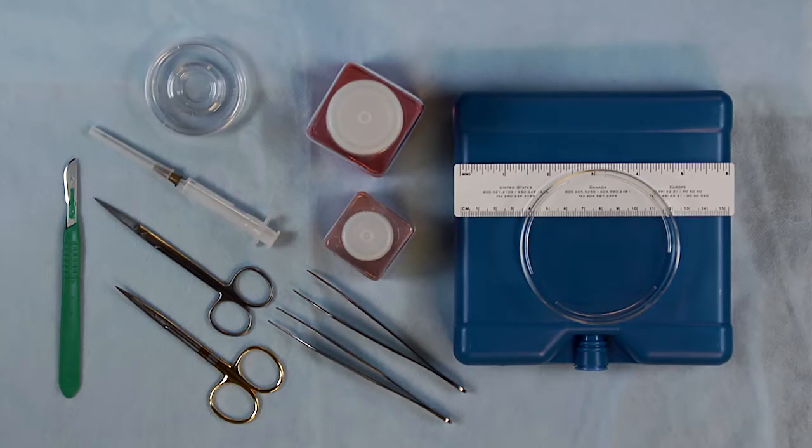And petri dishes. If you are aspirating follicles directly from the tissue, you will also need an 18-gauge needle with a 3cc syringe.